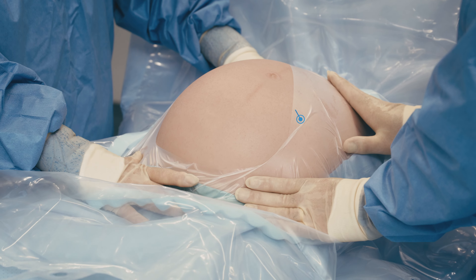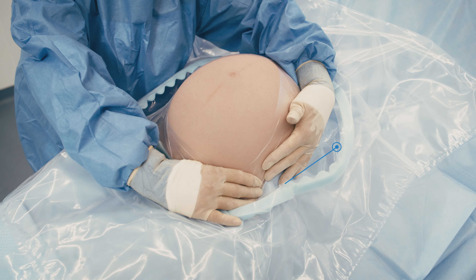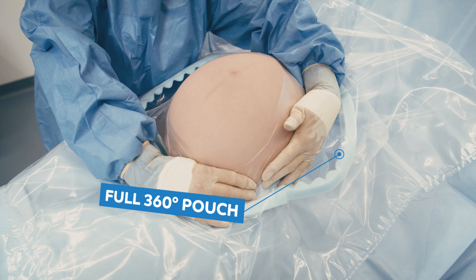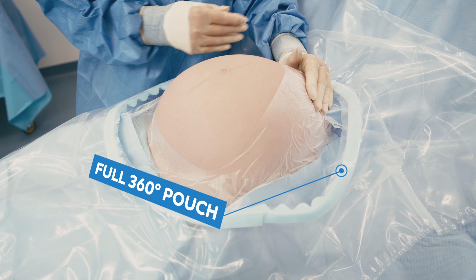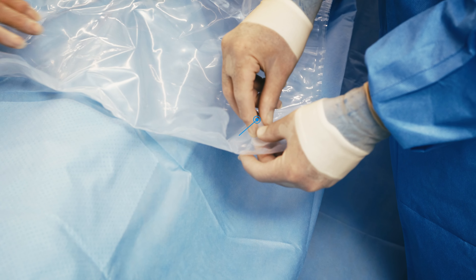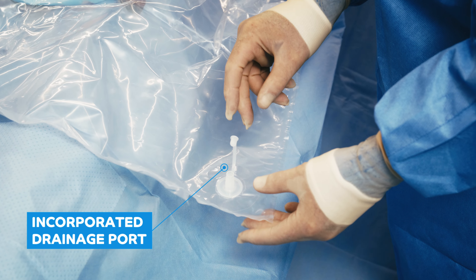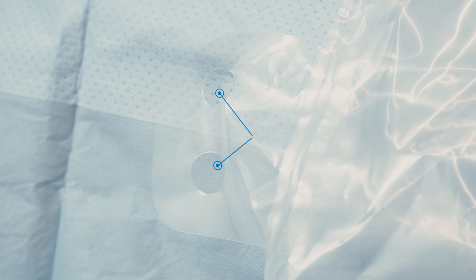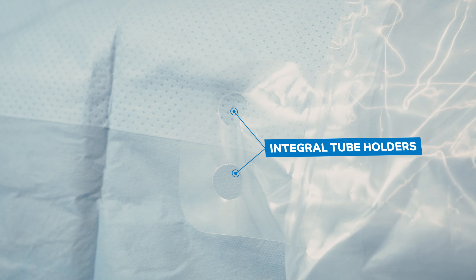A choice of full or fenestrated incise film options are available, while a full 360 degree pouch with a foam edge provides a soft and gentle frame, allowing the fluid to be captured within the pouch to prevent overflow. An incorporated drainage port allows for suction tubing to be connected if required, and integral tube holders are also featured as part of this procedural specific drape.